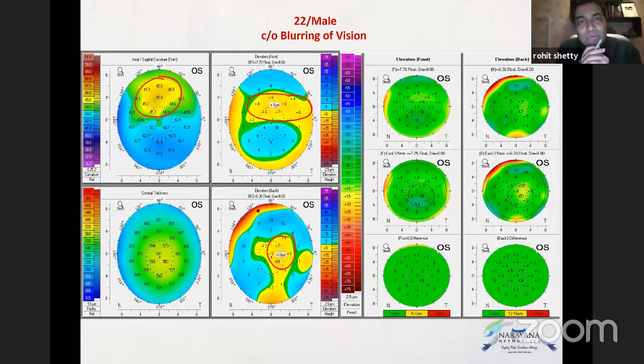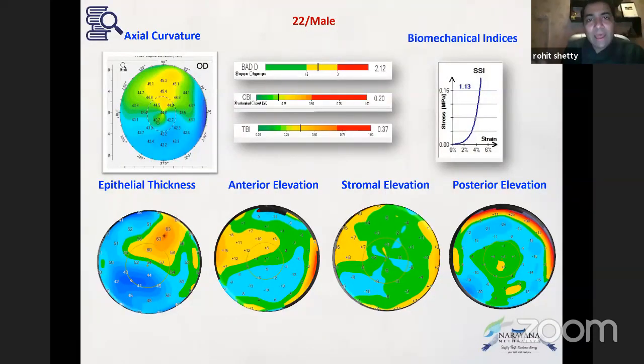The question is, a 22-year-old male coming like this, most of the time, the first sign of your diagnosis is, you would think that there is something to do with keratoconus. And what is interesting here is, if somebody uses both the Pentacam and the Corvis, the maps, the Savini Segura is here, so he'll be happy to know that the biomechanics, the CBI and his Segura report, was normal. A keratoconus-looking picture but a normal biomechanics is something which we need to go and see what is happening out here.